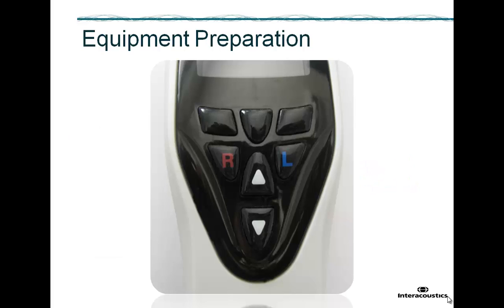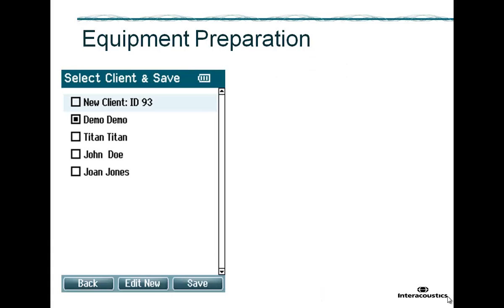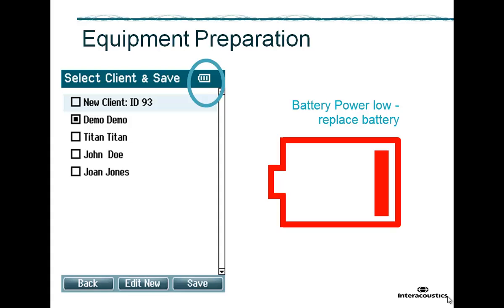Switch Titan on by pressing the L or the R button on the device. Notice that you can check how full the battery is in the top right hand corner of the screen. When Titan's battery power becomes low, the battery symbol shows red and it is recommended to replace the battery.